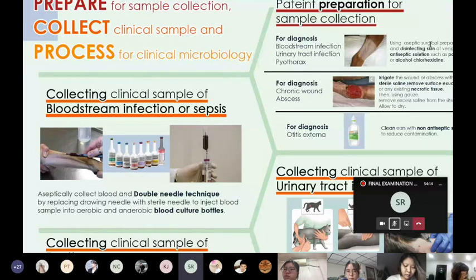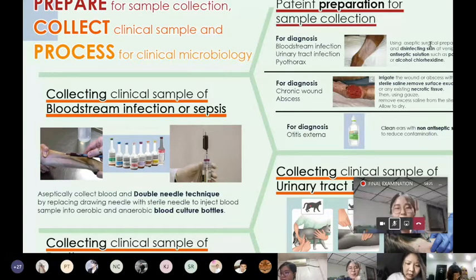Because if it is clot in the syringe, it can't push out. Maybe sometimes it will go out with the clotting, but a little bit of the clotting does not obstruct the syringe. I don't know if it can be clot in the bottle or not. But sometimes in the clinical, the syringe can be clot but not obstruct. Do you understand me? I don't know, so I asked.